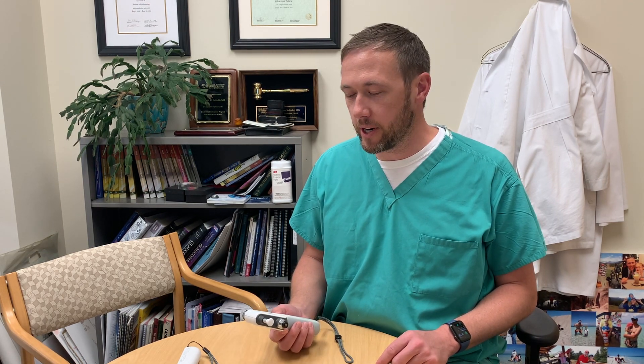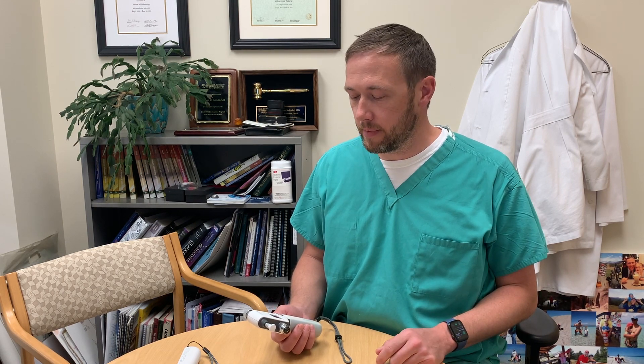Hi, everyone. This is Dr. Seibold. I'm here today to go over the basic function and operation of the eye care tonometers. We now have two models in clinic available today: the IC100, the original model, and then the newer IC200 model. And you'll see both of these in the various clinic pods.